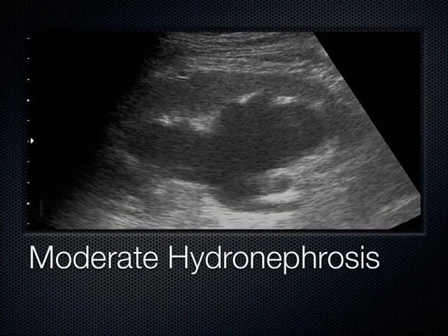This is what happens when we get a lot of hydronephrosis backing up in the kidney. Our cortex is starting to go away, and all those finger-like projections are now coalescing to one large hypo or anechoic area here seen in the pelvis of the kidney, and that's more like moderate hydronephrosis. When all those fingers kind of come together, we can still make out the cortex though. See out here, we can still see cortex.